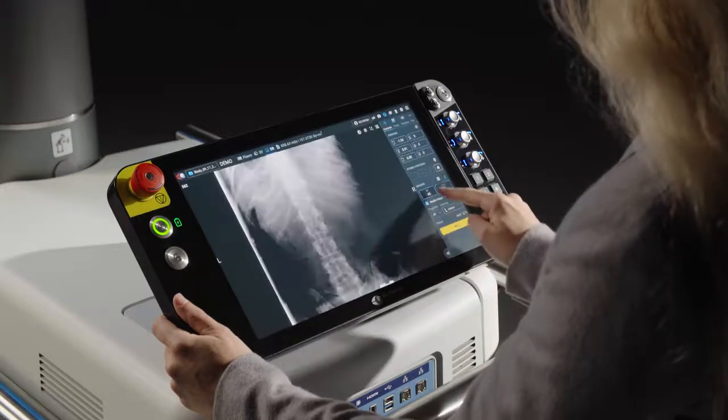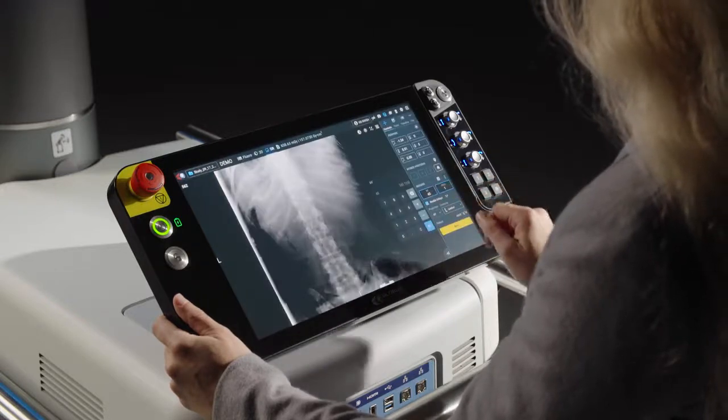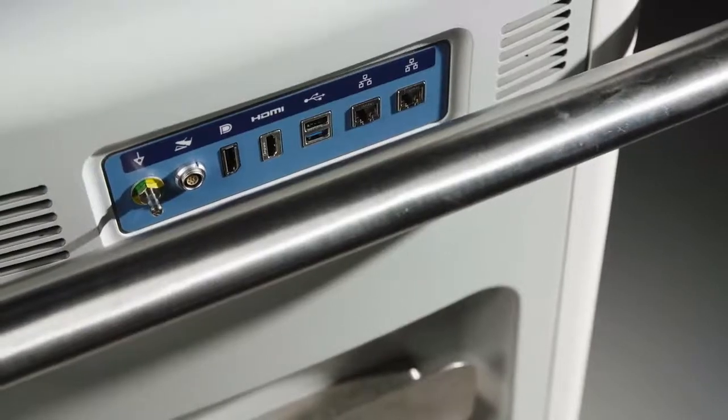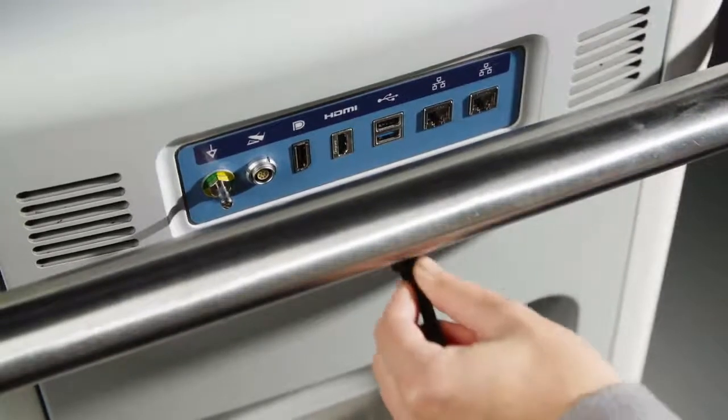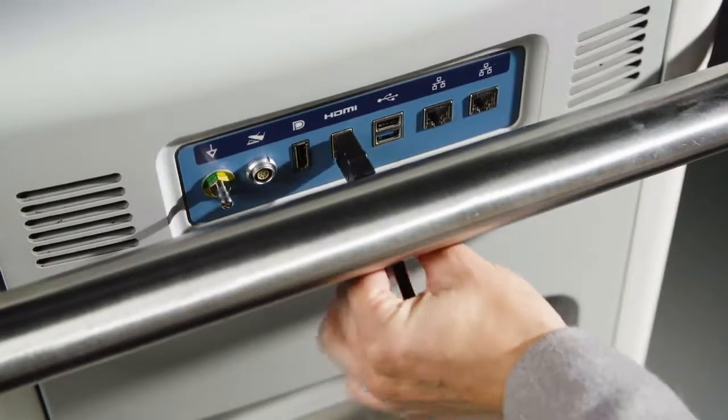The acquisition presets are optimized by imaging modality, dose option, patient size, and target anatomy. At the rear of the system, the connector panel allows various connections for additional display options to other monitors.